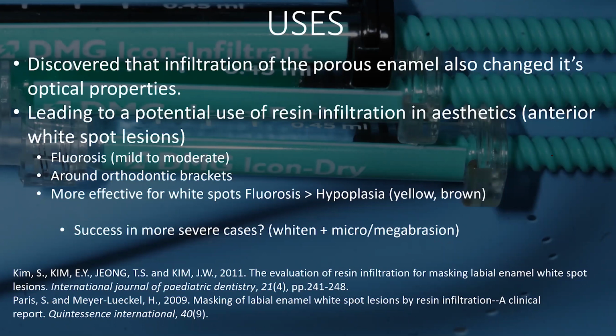I've personally found, and some people also agree, that it's probably more effective for white spots. I'd go a bit further and say that maybe it was for the diffuse white spots as opposed to the really well-defined white spots. I just found that you probably get more success with those in terms of your 2 or 3 applications and actually dealing with the lesion.